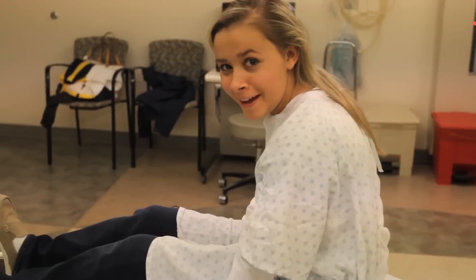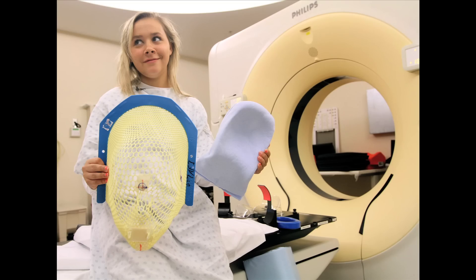That wasn't so bad. The next step is to start radiation therapy, where we'll use the same mask over the face and head.